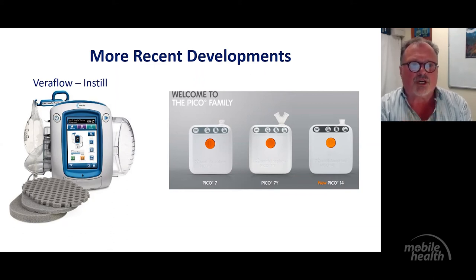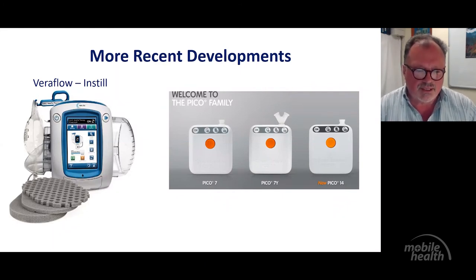So basically what I just wanted to show is that this type of negative pressure system is developing all the time. They're hopefully getting simpler to use. They're more patient friendly. It's all about flexibility. It's all about people being able to use it easily. They can go their normal way at home, and people don't find it too cumbersome to use a pump at home. Because even those canister pumps, which are smaller, those portable ones, can be quite risky to use for an aged person who is quite fragile and there's a risk of falls. And we want to avoid those.